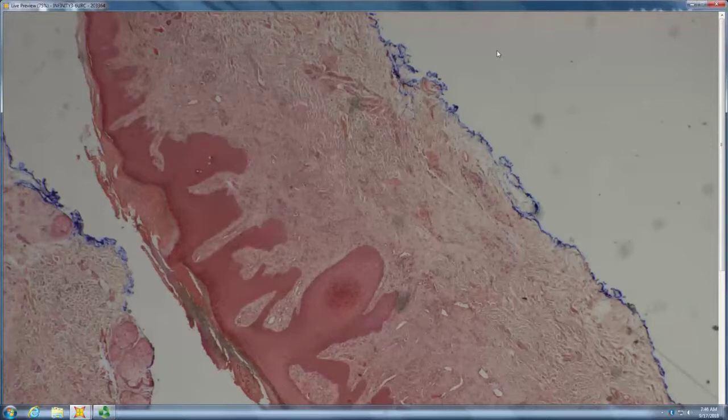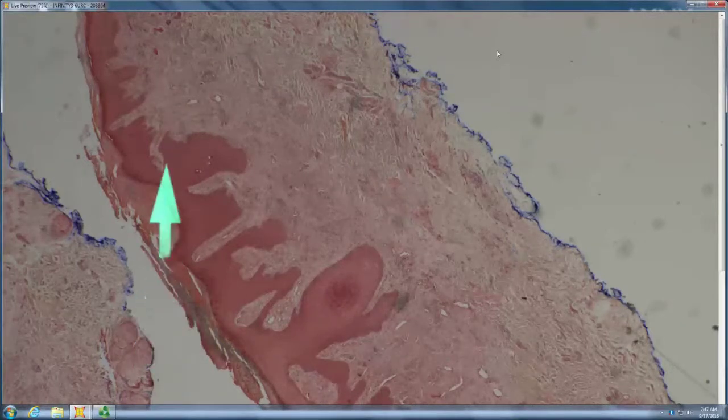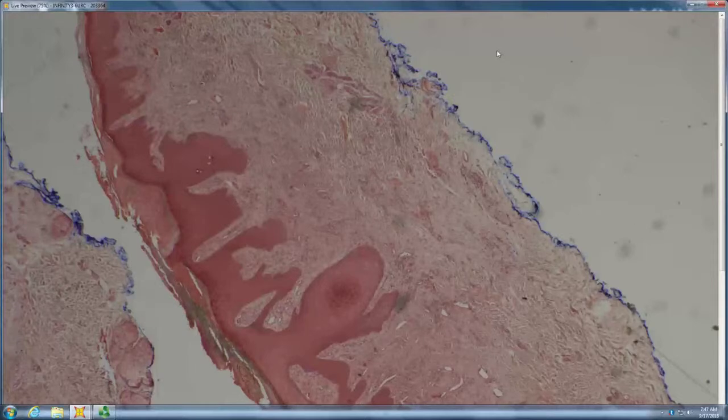But it has the very irregular acanthosis. Why is the acanthosis so irregular in LSC and prurigo? Because the only thing that becomes acanthotic is the adnexal epithelium. So all of these little skinny things up here are the pre-existing epidermis, and everything that's massive, you can see the ducts in it, or the hypergranulosis of the center of a hair follicle. So it's the adnexal structures that become acanthotic in LSC, and the intervening epidermis is the thin, skinny stuff. Okay.